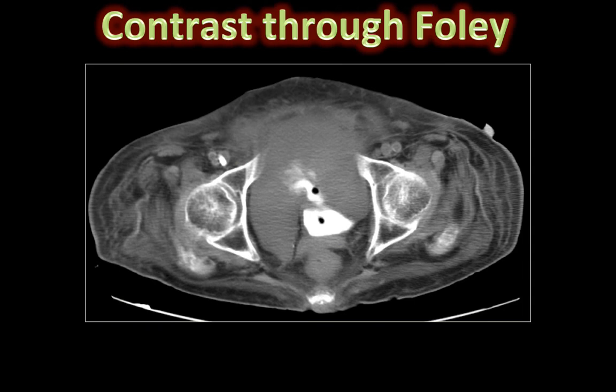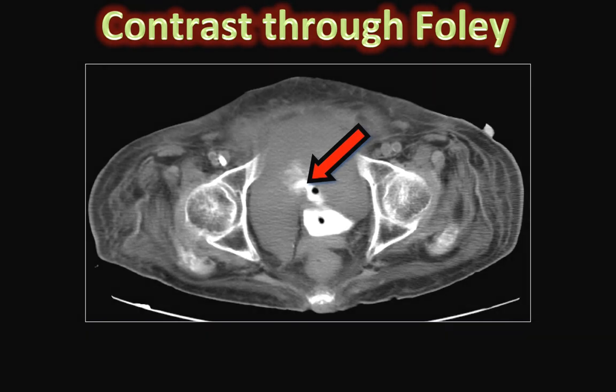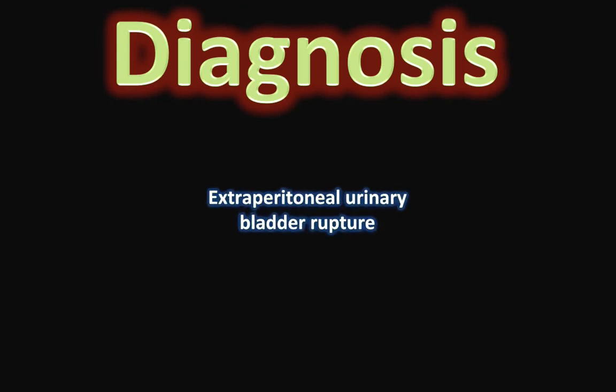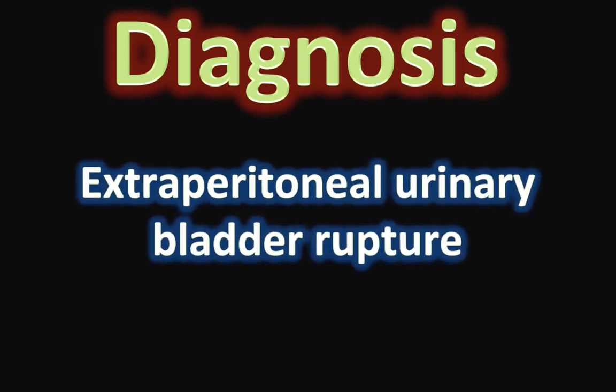This is another image where contrast was injected through the Foley catheter, clearly showing that there is contrast extravasation from the collapsed urinary bladder into the fluid collection within the pre-vesicle space. An appearance that is consistent with extraperitoneal urinary bladder rupture.